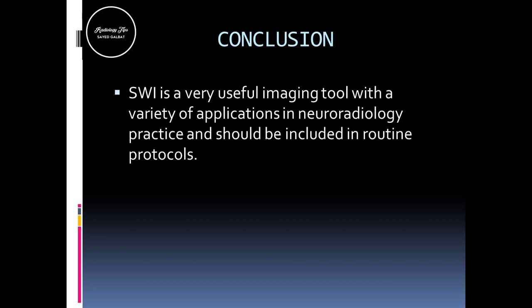So to conclude, SWI is a very useful imaging tool with a variety of applications in neuroradiology practice and should be included in routine protocols.